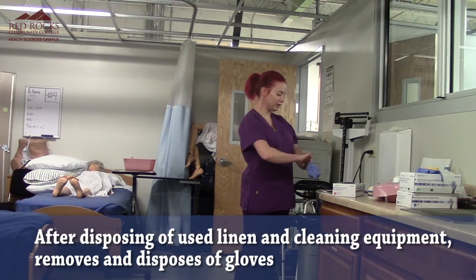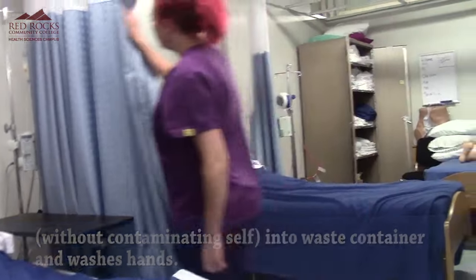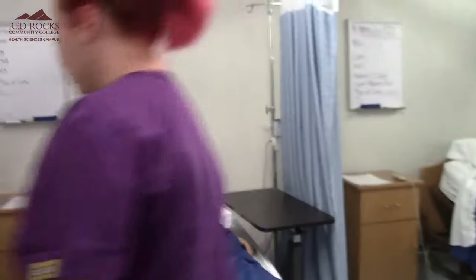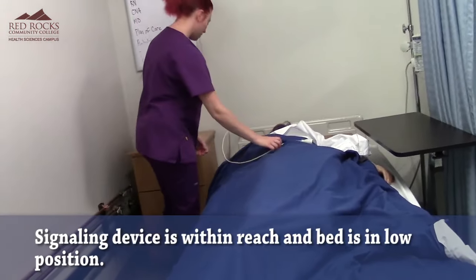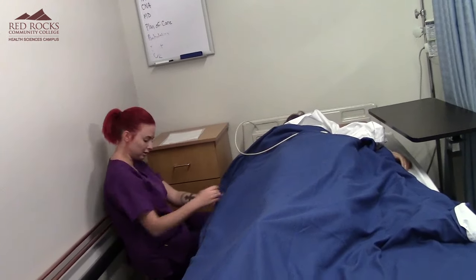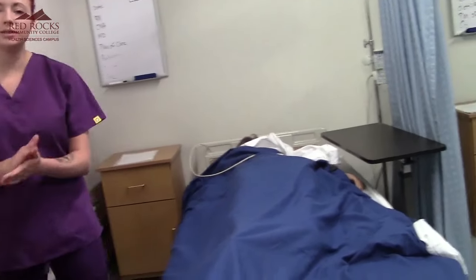I'm going to remove my gloves and wash my hands. Mary, I'm going to open your curtain. Now if you need anything else, here's your call light. I'm going to make sure that this bed is in the lowest position by pressing my button. And then I'm going to wash my hands.